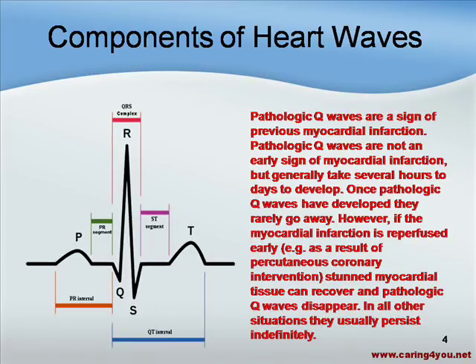Now let's talk about the QRS complex. Pathological Q waves are a sign of previous myocardial infarction. On a normal EKG, you would expect to see a slightly inverted Q wave — just slightly inverted. This will be the baseline for the Q. But if you see a very inverted Q wave, this is a sign of a previous myocardial infarction.